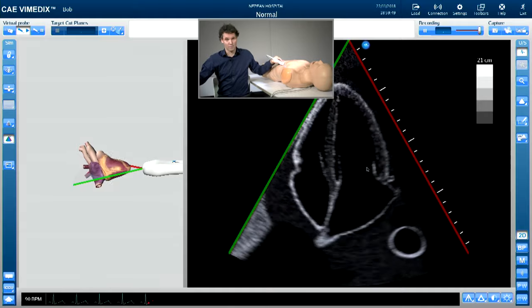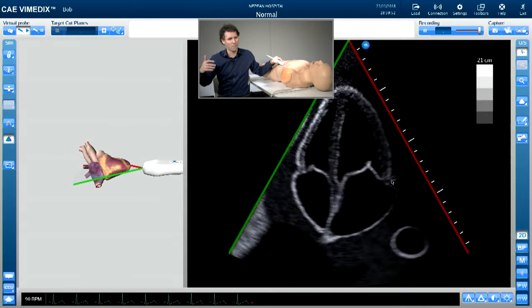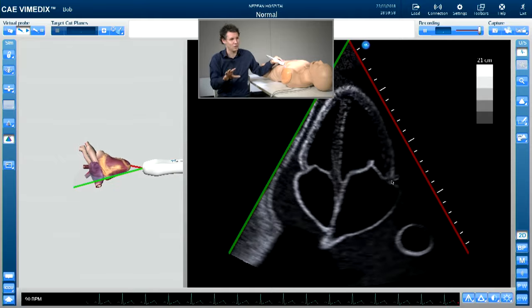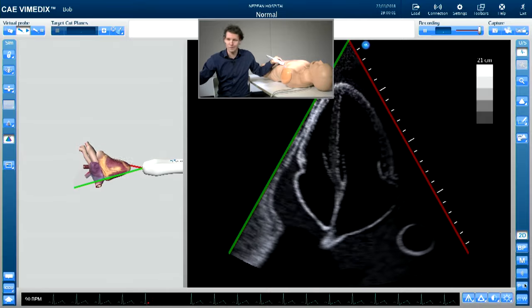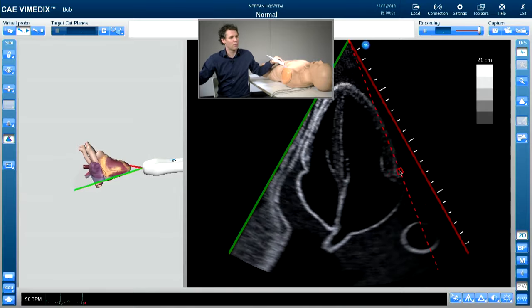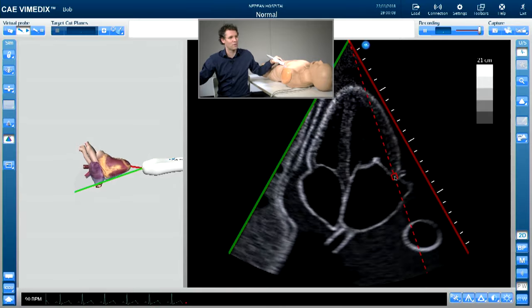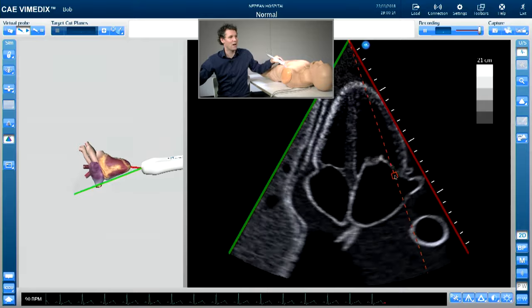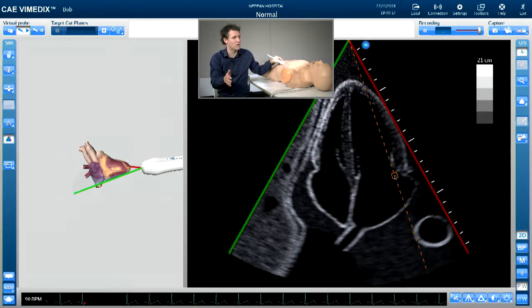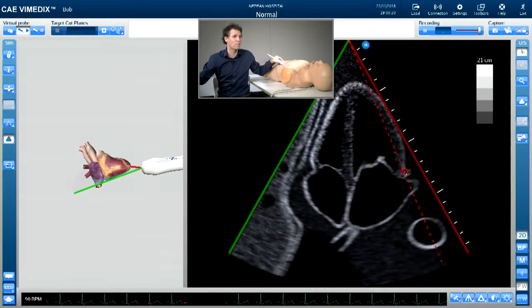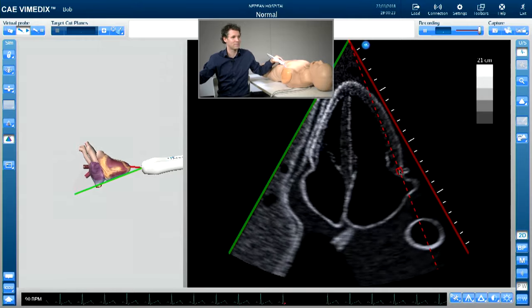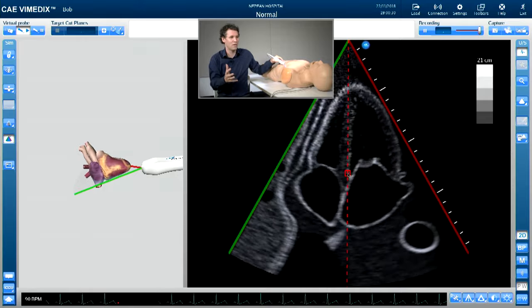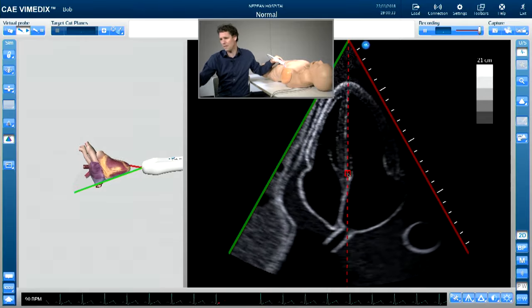The next part of the comprehensive study is going to look at tissue Doppler imaging. With tissue Doppler imaging, we're going to ignore the fast moving blood and just focus on the slower moving tissue. It's angle dependent, just the same as all Doppler, so we've got to make sure that if we're trying to assess the movement of the lateral annulus of the mitral valve leaflet towards the apex, we try and make sure that the interventricular septum is right down the middle of the screen. Here I'm assessing the movement from the medial mitral annulus towards the apex.